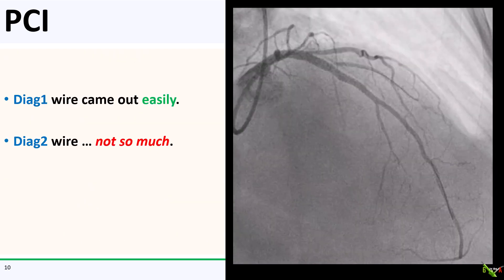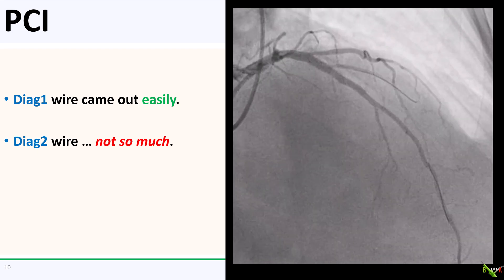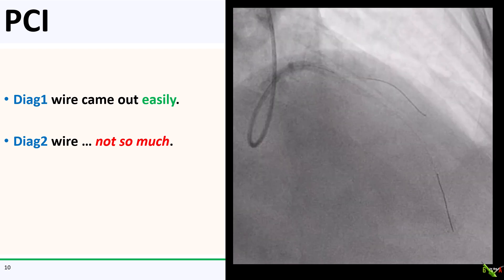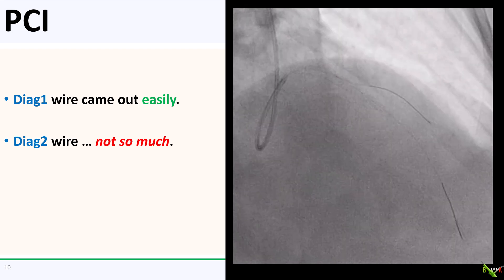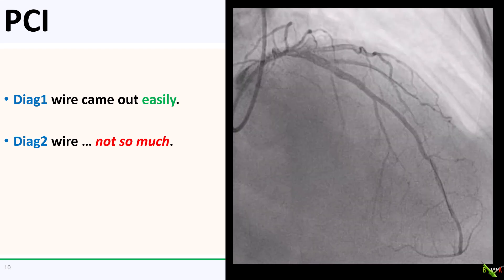The wire in the first diagonal came out easily. The wire in the second diagonal — not so much. I tugged and tugged at it, but all that did was deep seat the guide into the LAD. That wire was stuck. So what do we do now?